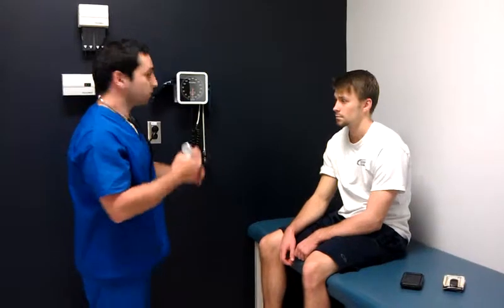Next, we would assess the patient's height and weight. He would lie up against the wall in a straight posture, heels against the wall, and the most accurate height measurement will be taken. When taking measurement for the weight, the scale must be calibrated before the patient steps on. If the patient happens to be on dialysis, it's important to just take the dry weight measurement. And that concludes the assessment.